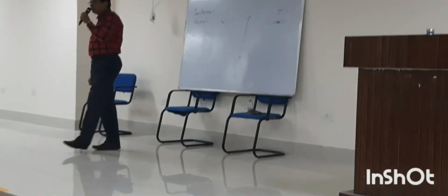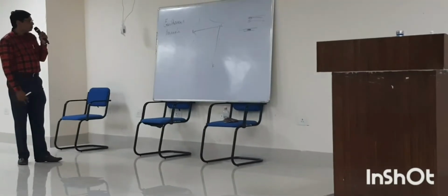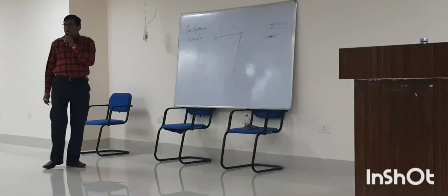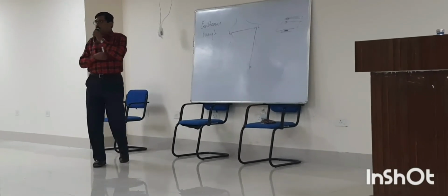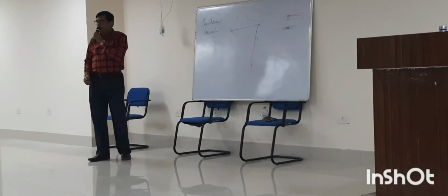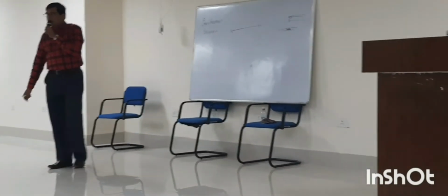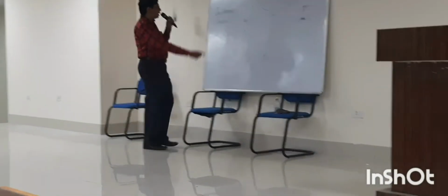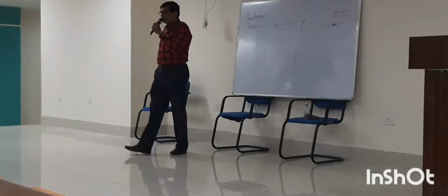Scientists have postulated an equilateral triangle, the vertices of which are the right arm, the left arm, and the midpoint of the inguinal ligament of the left side. So right arm, left arm, and below.